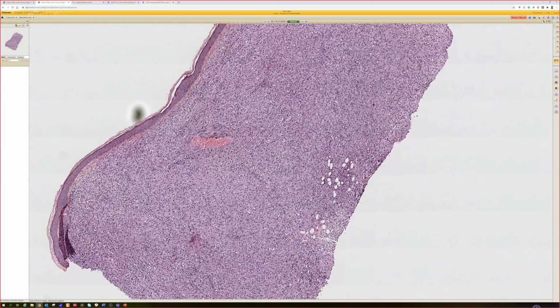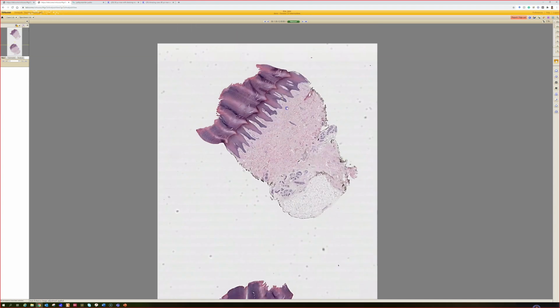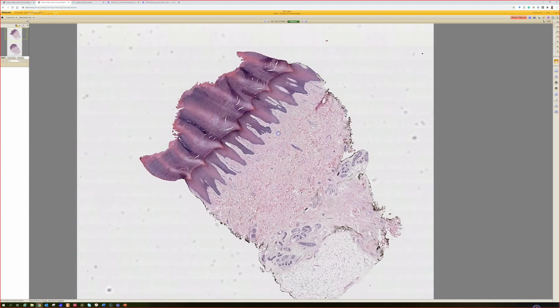So this is Lepromatous leprosy. And of course, as you guys know, there's all this borderline Lepromatous, and I've always found that much more complicated, and it really, to me, depends kind of on the clinical situation. This is a great example of something we don't see very often. Case number 12.